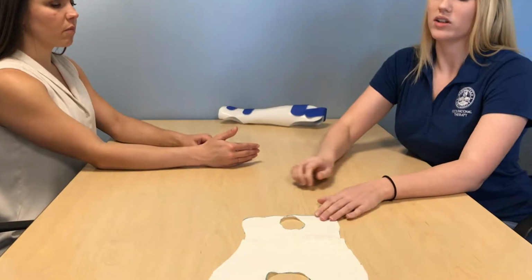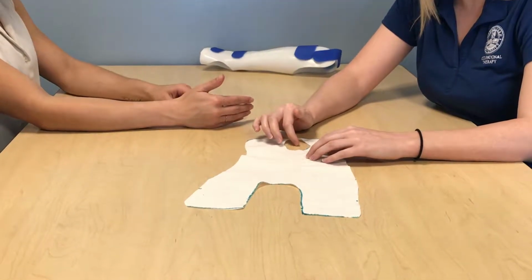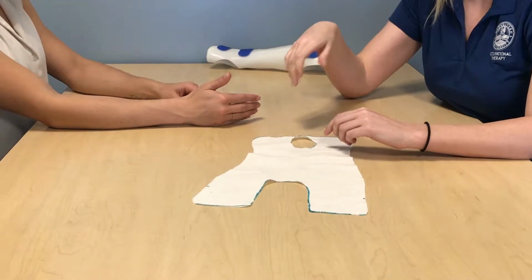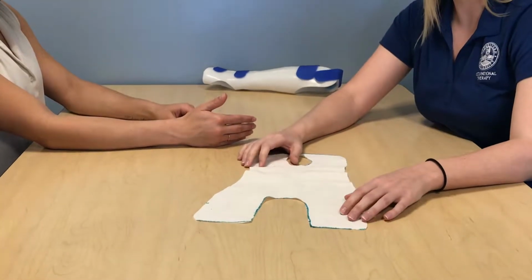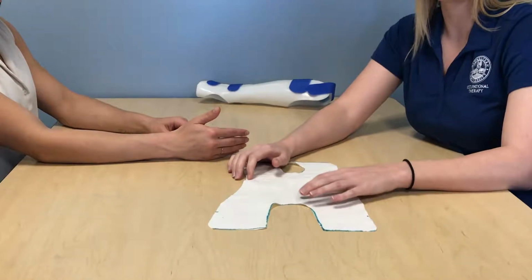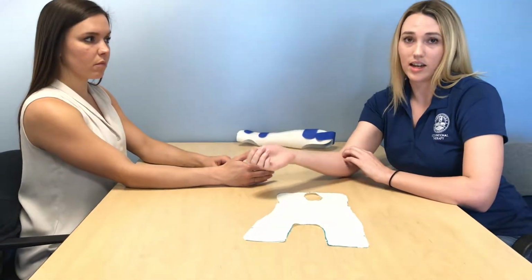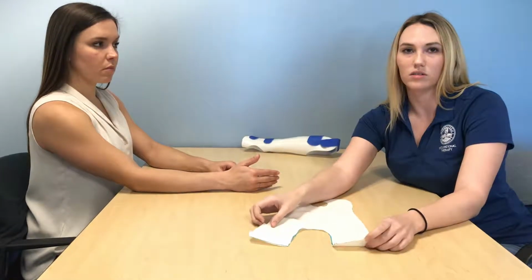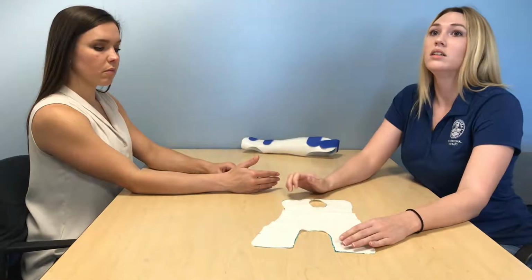So when doing the pattern, we wanted to make sure that it would clear her thenar eminence, so that she could oppose all of her digits. It would clear her distal palmar crease for the same reasons, and also to leave a space for her elbow to be able to flex and extend. But we also wanted to support her elbow, so we have flaps that will cover her medial and lateral epicondyles.